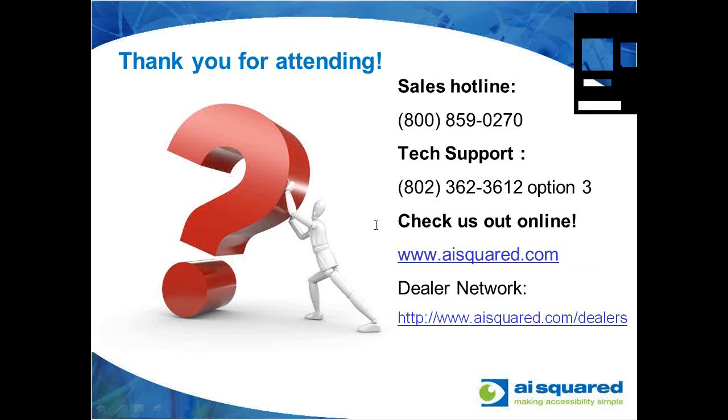One other thing, I don't know if you mentioned using your own webcam if you already have one. Yeah, you can use your own webcam. The only thing I will caution you with is if you don't have a good stand set up, it's going to be very difficult. Holding the camera above the printed material that you're looking at is going to be jittering and moving all over the place and just very difficult to use.